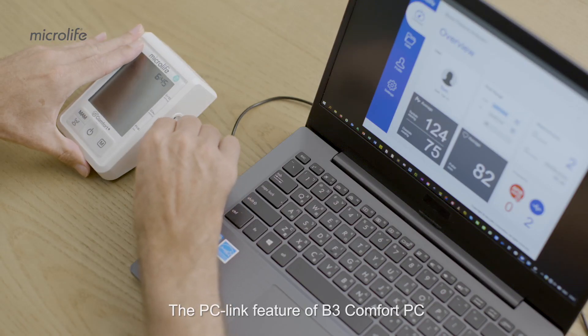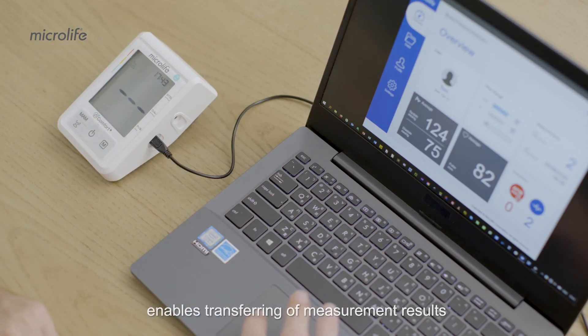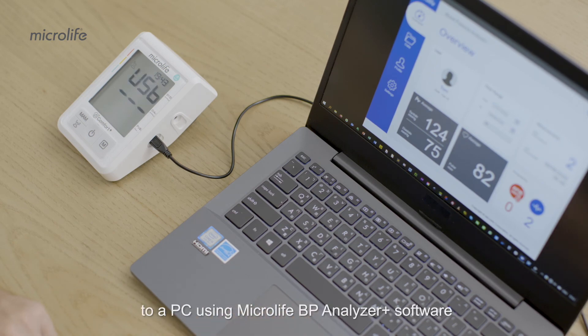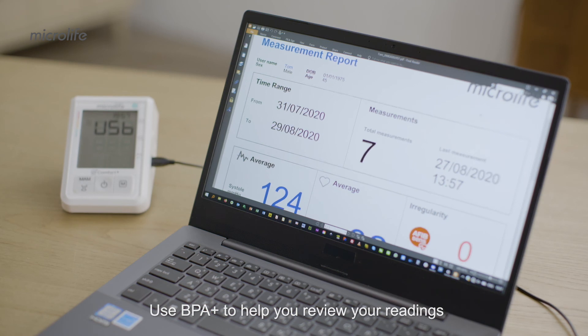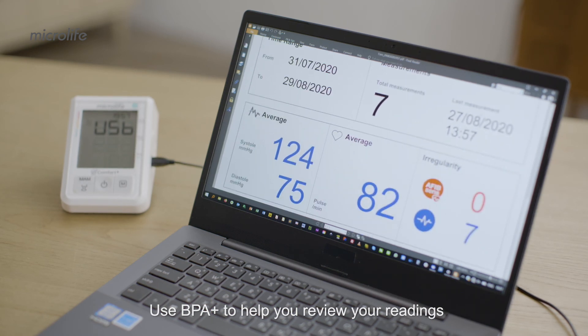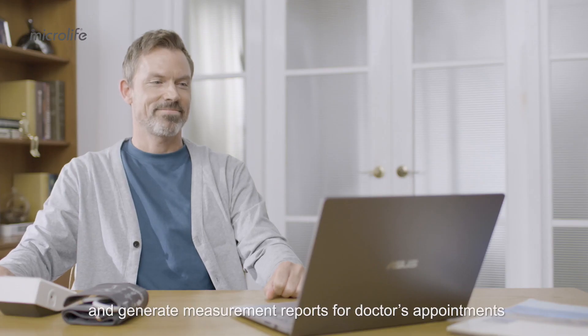The PC link feature of B3 Comfort PC enables transferring of measurement results to a PC using MicroLife BP Analyzer Plus software. Use BPA Plus to help you review your readings and generate measurement reports for doctor's appointments.